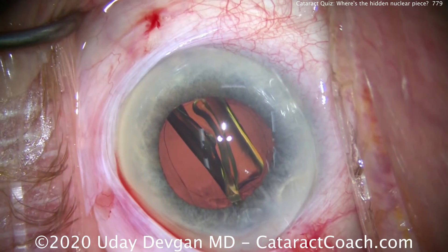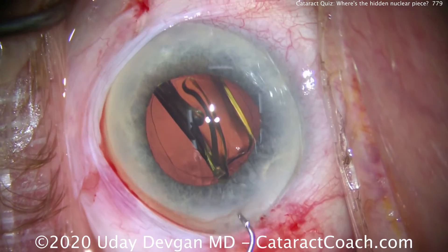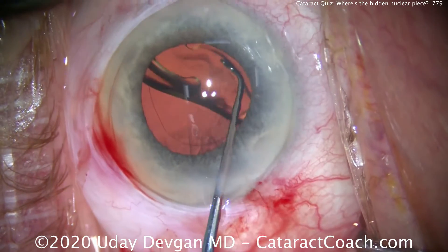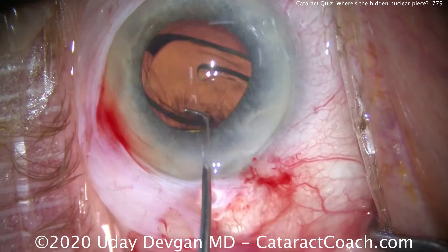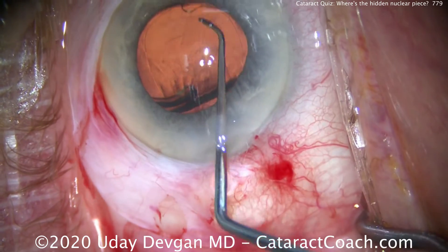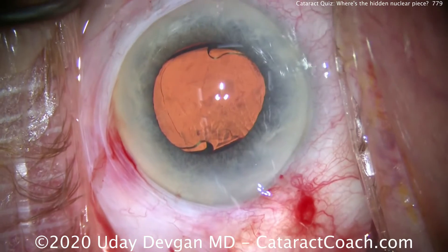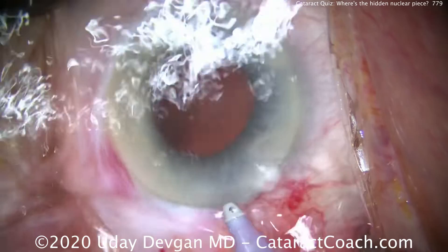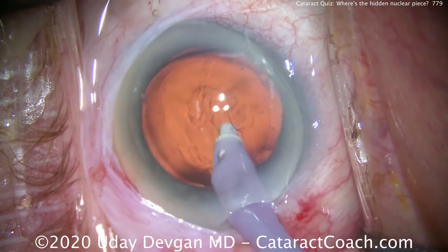Watch carefully. Place the optic and the haptics in the bag, nice and easy, and rotate this around. If you haven't seen it already, the piece is just to the right of the main incision in the angle of the eye. As I put the IA probe in the eye, it'll dislodge that piece.